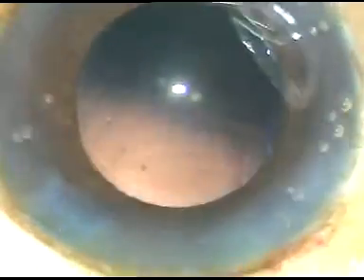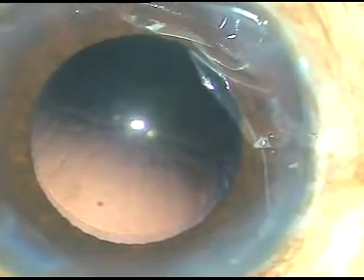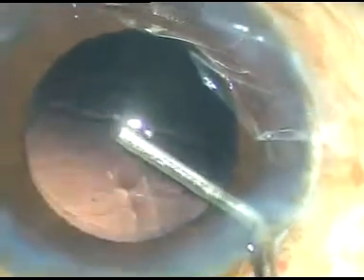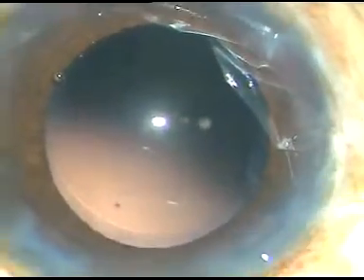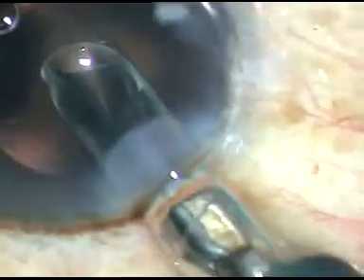Now, viscoelastic substance is injected to fill up the capsular bag as well as the anterior chamber. This is HPMC, hydroxypropyl methyl cellulose. This is a multi-piece intraocular lens. For introduction of this cartridge, I usually, and in this case also, have increased the incision by 0.2 millimeter and have made the incision size 3 millimeter.